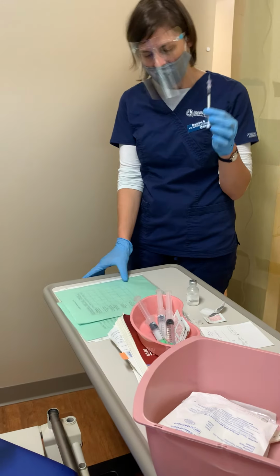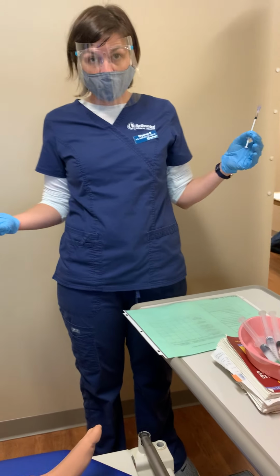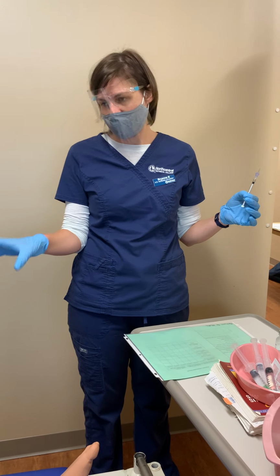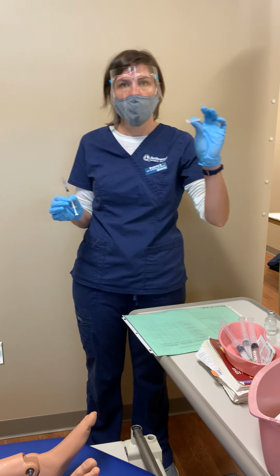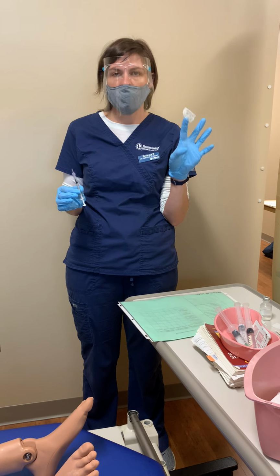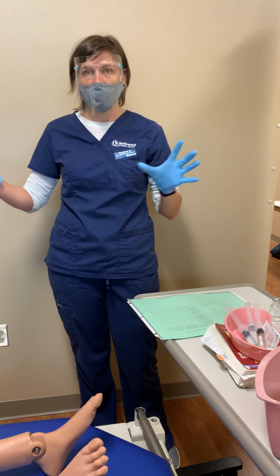All right, now that I am dose accurate here, I'm going to do my 5 checks. Again, even though I did just check, I would be making sure that I am with the right patient. I haven't left the room, so it's not an issue. But if I were to leave the room, I do have my label stating that I have morphine 0.2 ml, which is 2 milligrams, that I would keep on my tube if I were to be pulled away at all.